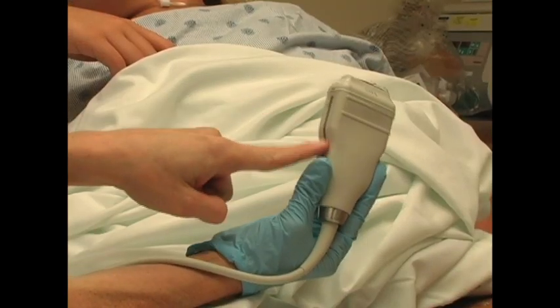In patients in whom you suspect the presence of DVT, the use of emergency ultrasound can provide significant benefit to both the patient and the physician. Because the treatment of DVT requires the use of anticoagulants, it has associated significant hemorrhagic risks.